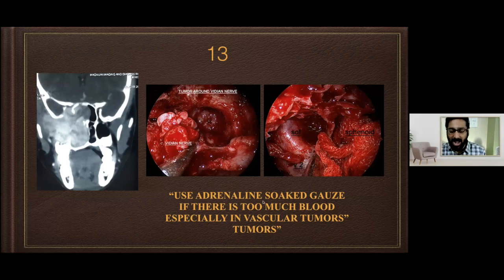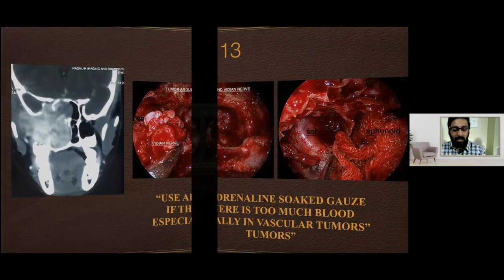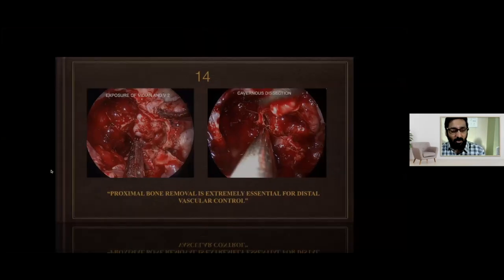So try to use adrenaline soaked gauze piece. I use 1 in 1,000 adrenaline soaked gauze piece just to control the bleeding. That's very important. And then try to remove all that bone.